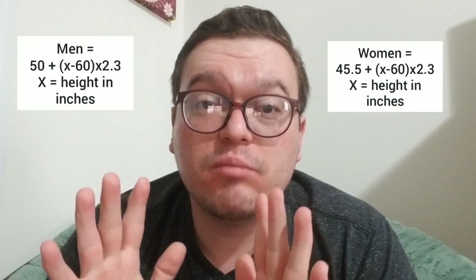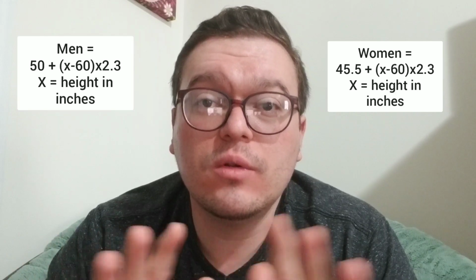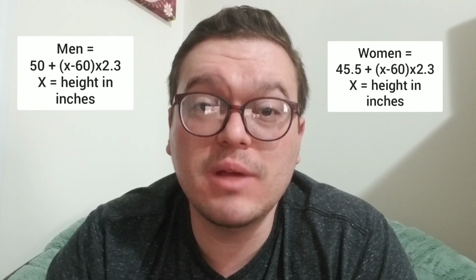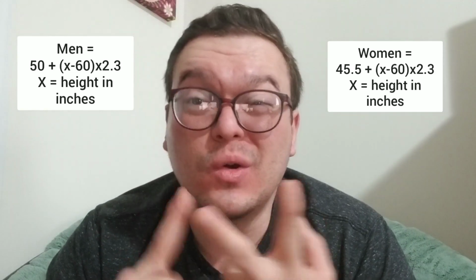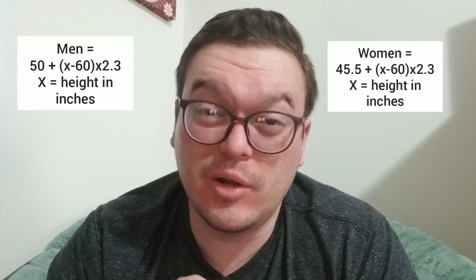If you're using a protective lung strategy with low tidal volumes, you want to use 6 milliliters per kilogram of ideal body weight. Remember, just because you get fatter or you get skinnier doesn't mean your lungs get bigger or smaller. So a 5'10" male would need approximately 438. You could round up to 450 or go down to 420. 10 milliliters is not usually going to make so much of a difference in tidal volume. So somewhere between 420 and 450, 440, you should be okay for their tidal volumes.